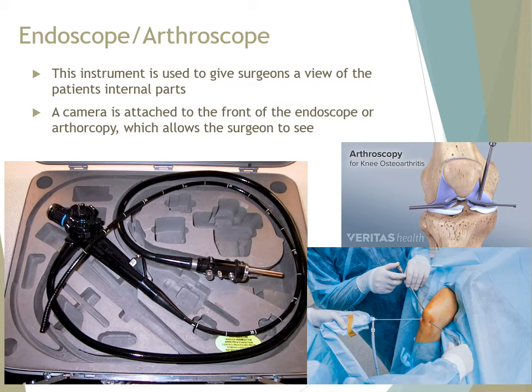You're doing it in a controlled environment, usually in the operating room, in such a way that the air is clean, the doors are clean, the tables are clean, and the patient is wrapped, draped very well. If you look at the leg, you see the brownish coloration. It means that the skin has been sterilized with betadine solution, because you really want to ensure that, since bacteria can live on the skin as well.